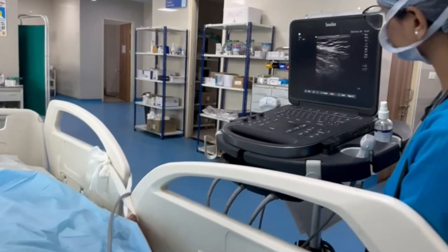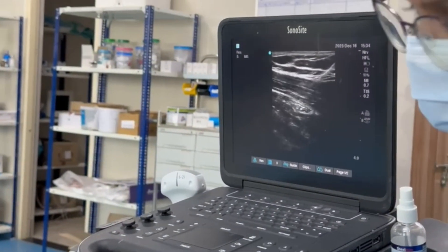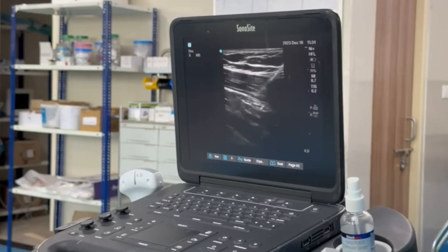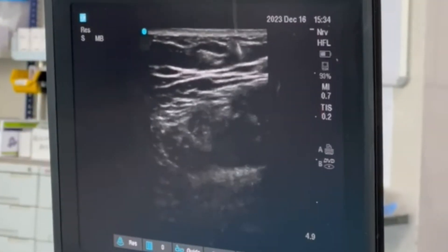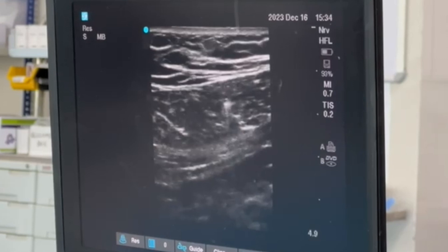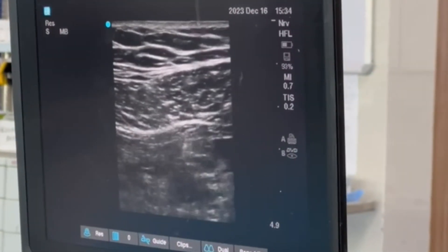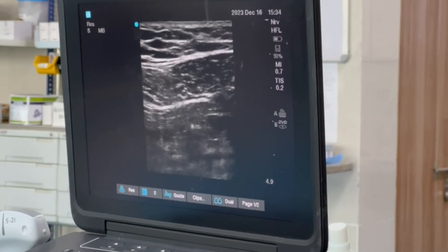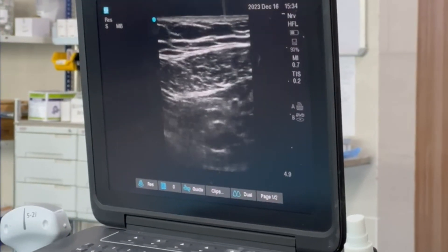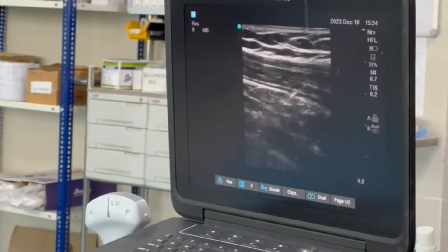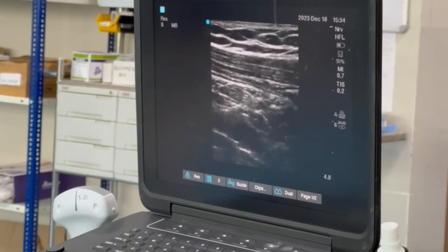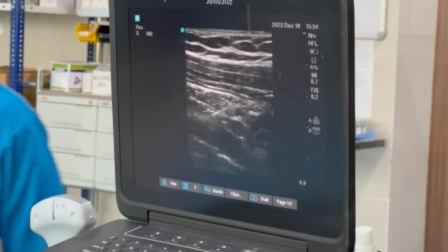Confirm the guidewire position: first confirm it in the short-axis view, and then rotate the probe to get a view of the guidewire in the long-axis view. Here you can see the guidewire is in the subclavian vein.